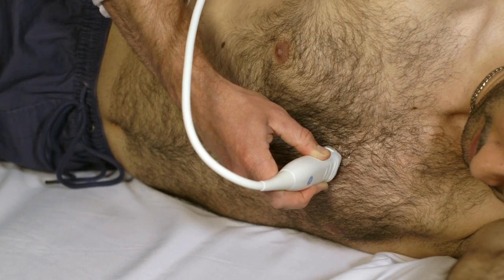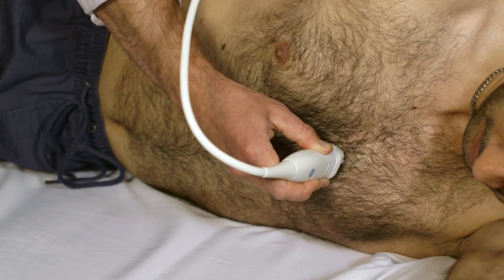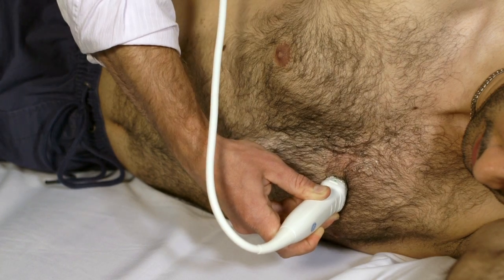Next, find the best window into the heart. This may be up or down 1 or 2 rib spaces. You may also need to slide laterally away from the sternum. Once you see the heart, optimize the image.